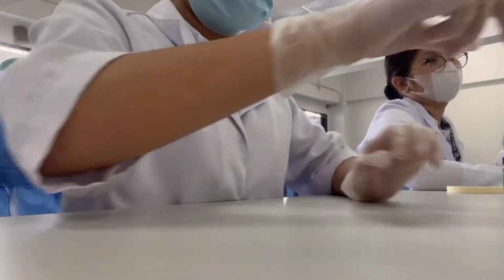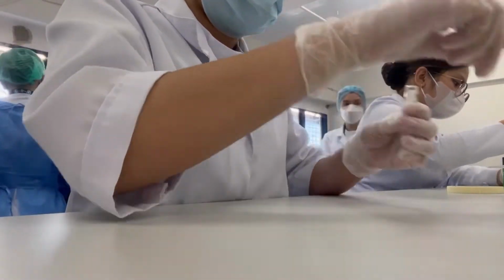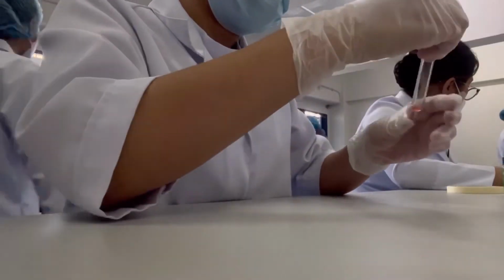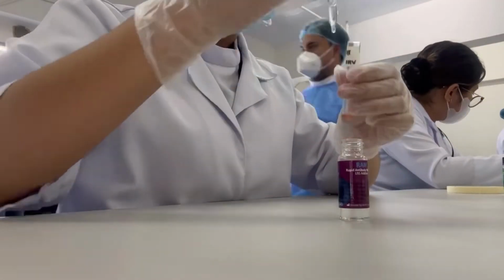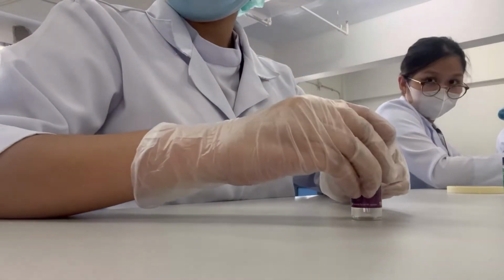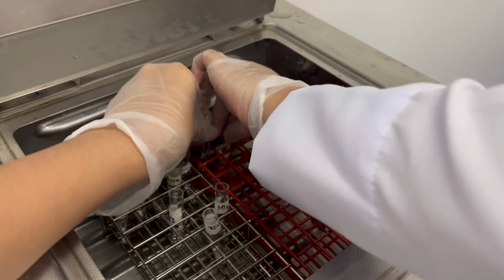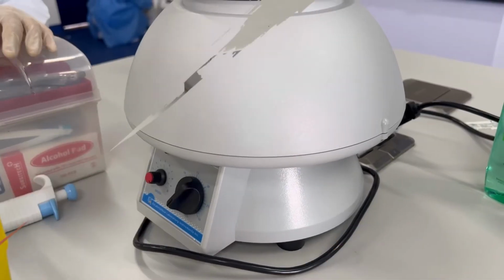Add 2 drops of patient serum to the test tube. Then, add 1 drop of 5% group O red cell suspension. Then lastly, add 2 drops of LISS. Then, incubate for 10 to 15 minutes at 37 degrees Celsius.